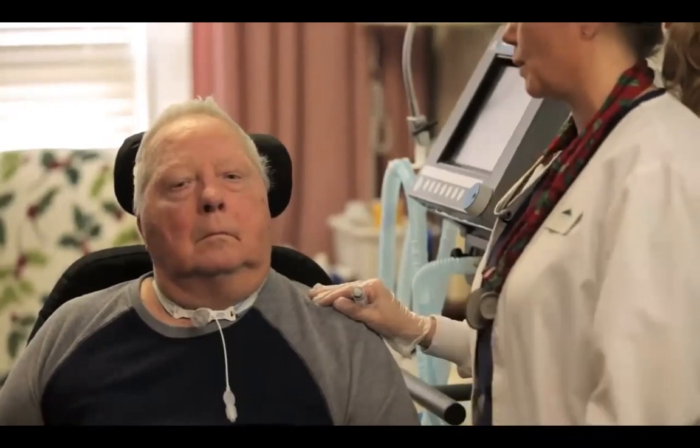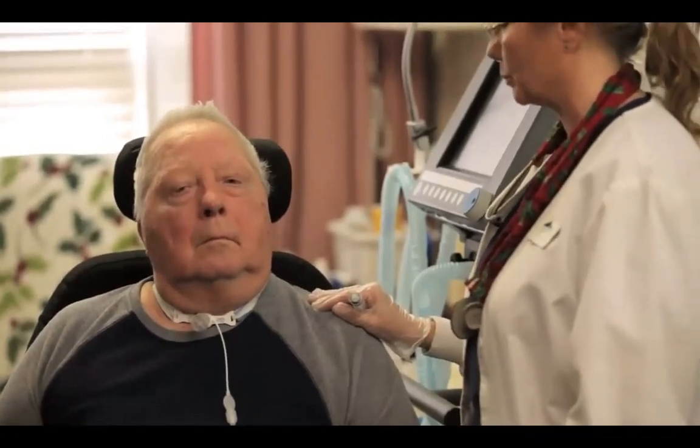Work you up, or airway gets stronger there. Why do you like using the speaking valve? Because I can't talk otherwise. And I have to have it to eat. I don't know what else you want me to say.